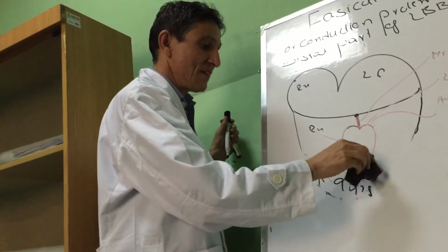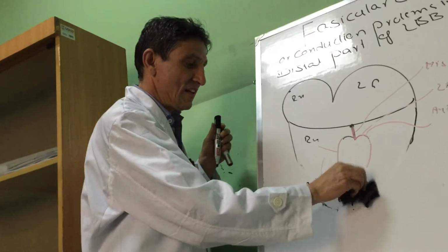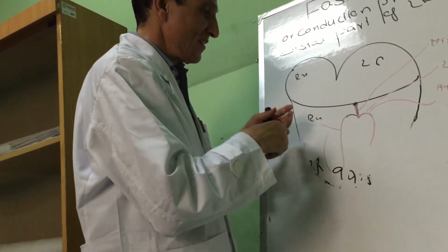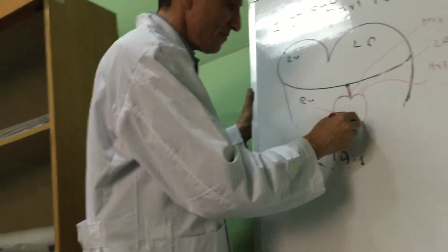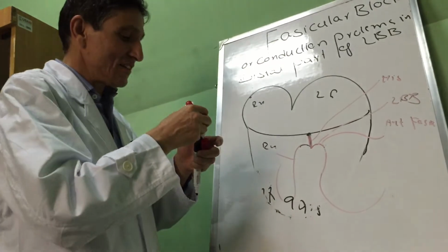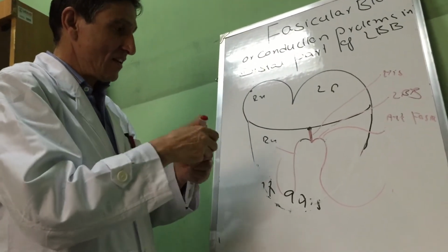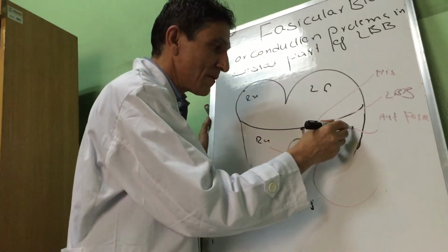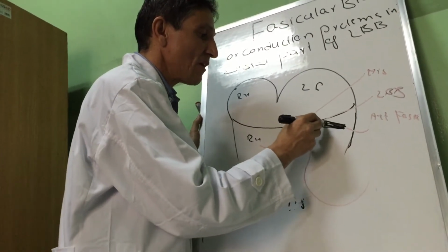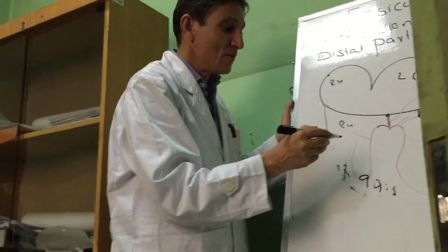Now this time, this patient has anterior fascicular block as well as posterior fascicular block.